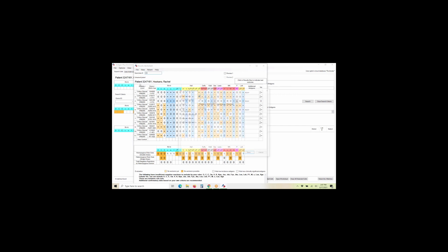We're just going to go ahead and save this panel. Close everything down. Now we're going to load the panel that we just tested and load the original screen and panel that we had already looked at. We're going to merge it all together.